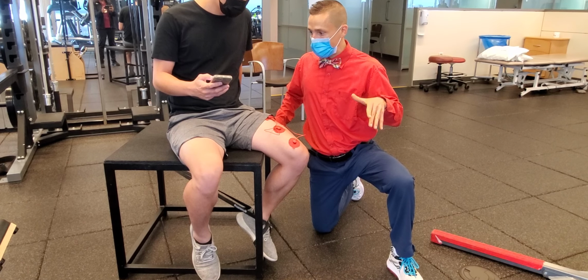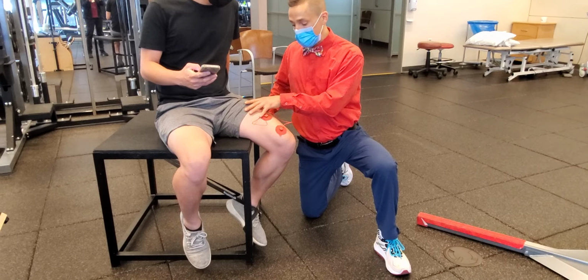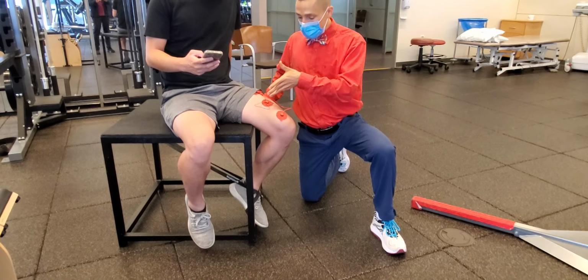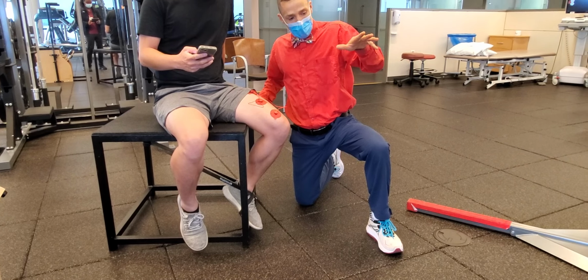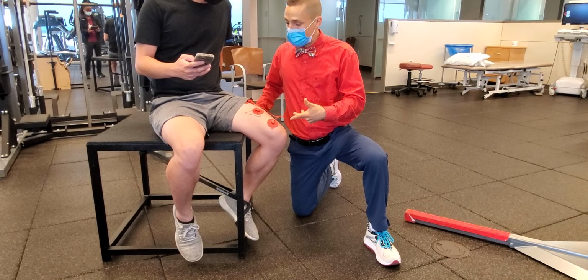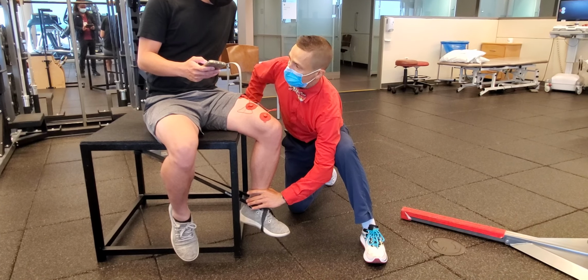So, arc of motion as you kick out against the resistance band. We're going to use the NMES device to assist you through the arc of motion. It's going to be a 10-second contraction. You're going to try and go all the way up, all the way down, within that 10-second mean. Okay? So here we go. You're going to go ahead and hit the start.